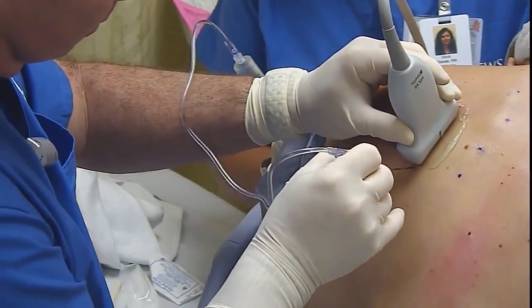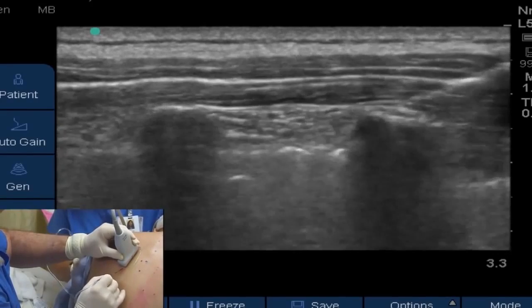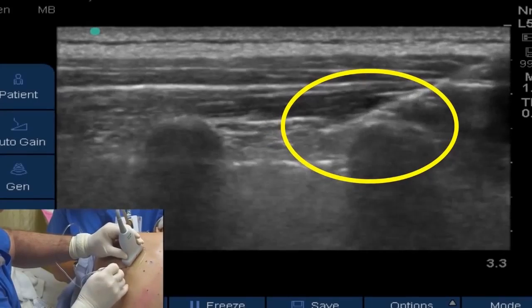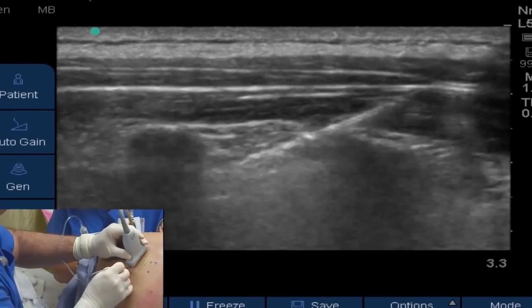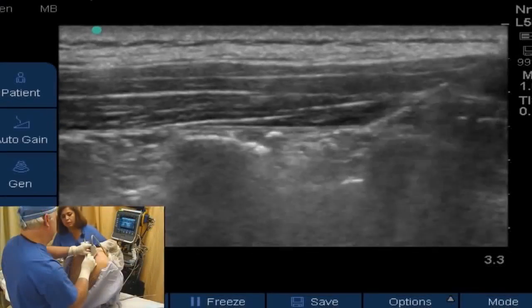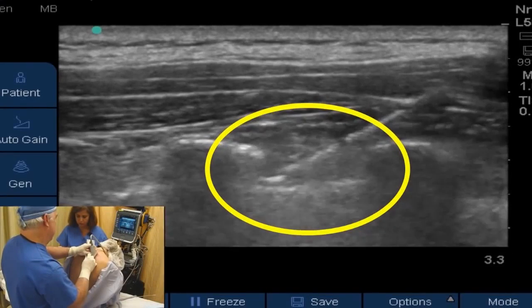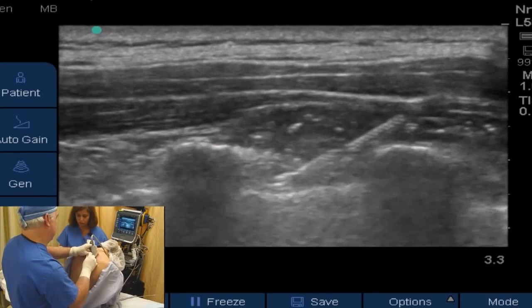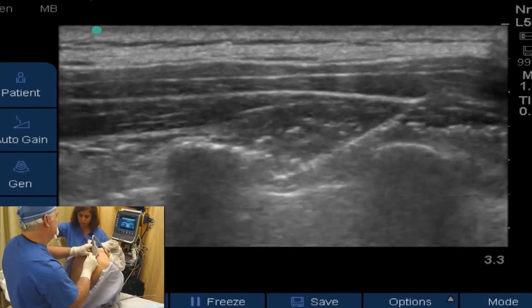With this Sano Tui needle, it has the echogenic markings on the last two centimeters of the needle, so it makes it very easy to see as you see it approaching here, going right over the transverse process of T4. It's very critical in this block that you know where the tip of that needle is. You can see our Sano Tui advancing between the vertebrae, and the echogenicity of this needle really shines up well — it's extremely helpful when you're using this steep angle to be able to see it as you're approaching the pleura.